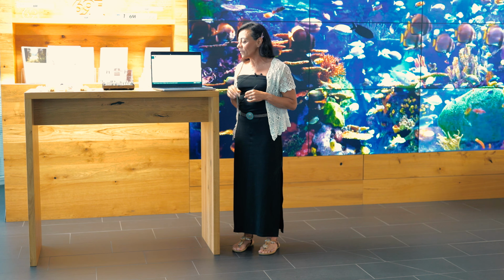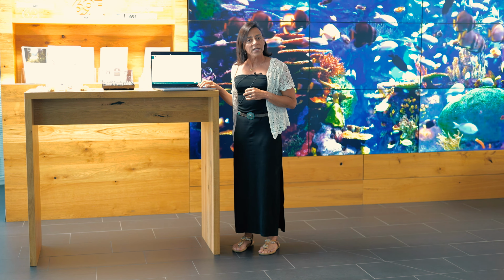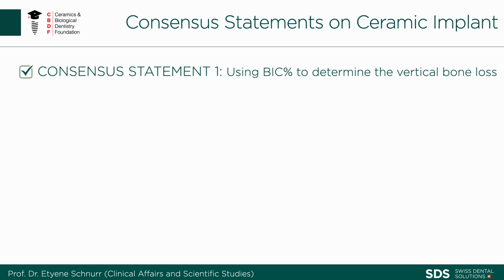Today, I will explain the first of 5 consensus statements from JCCI Congress on ceramic implant studies. Consensus statement number 1: using bone implant contact percent to determine the vertical bone loss.